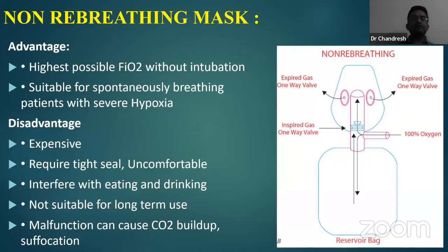And there are a few disadvantages, like definitely expensive, requires a tight seal, interferes with eating and drinking, and not suitable for long-term use. And there can sometimes be CO2 buildup if there is an oxygen disconnection.